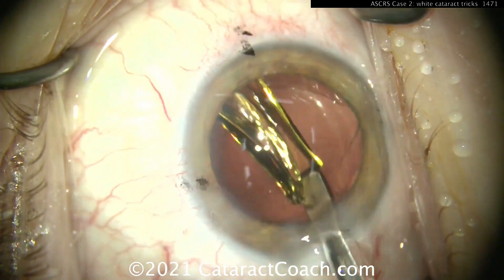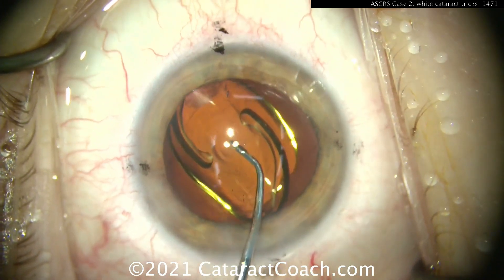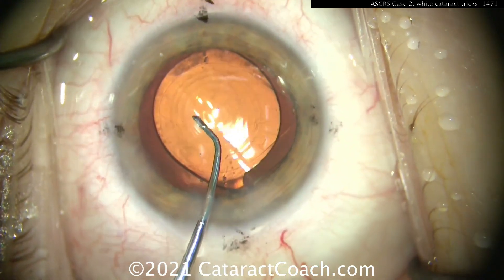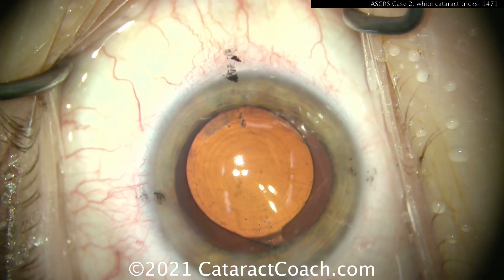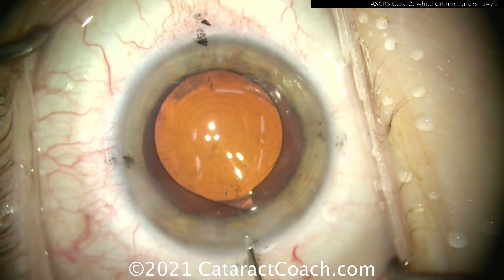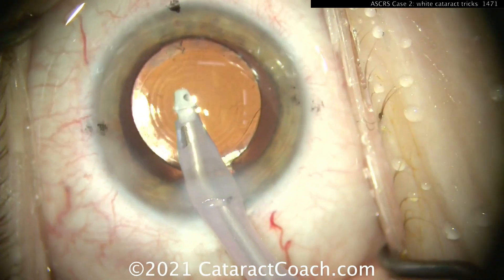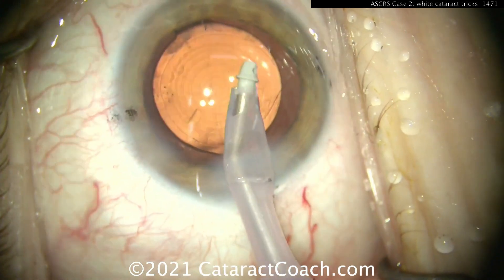Again, it's the second eye and the patient's getting a toric trifocal lens, so I have to put this lens in the bag — there is no option for sulcus placement. I'll get that in nice and easy and get it in the position I want. To remove viscoelastic, take it down by 50% on the IA parameters. Now put the IA probe down — actually, put it away. Get the BSS cannula. Let's seal up and hydrate the incisions first to make them more watertight. Now take out the viscoelastic — I'm not going to go behind the lens, I'm not going to stress the capsule. Just be nice and easy.